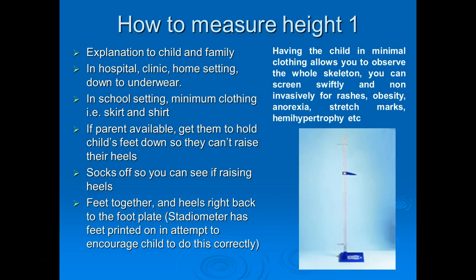If the parents are there, make use of them, get them to hold their child's feet down so the children don't rise up on their heels, which they have the temptation to do to make them appear taller. A good trick for seeing that is to take the children's socks off so you can actually see if they're raising their heels. The feet should be together, the heels at the back of the foot plate. Unfortunately, on the stadiometer, as you can see in this picture, there are feet printed on it in an attempt to encourage the child to do this correctly.